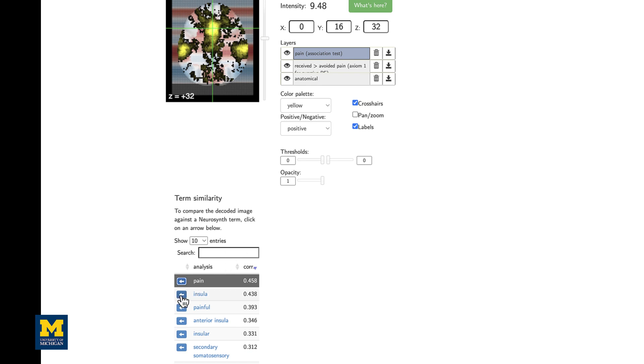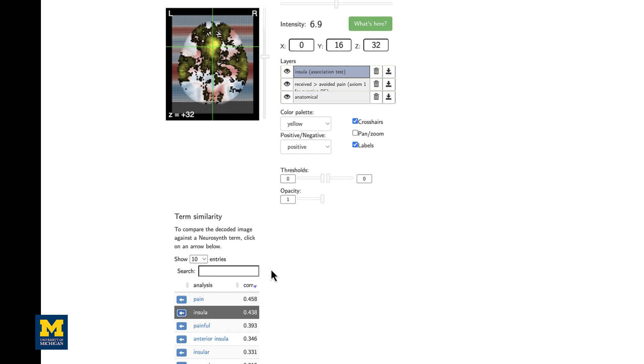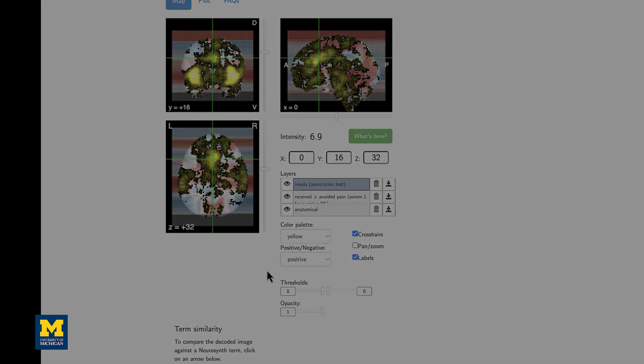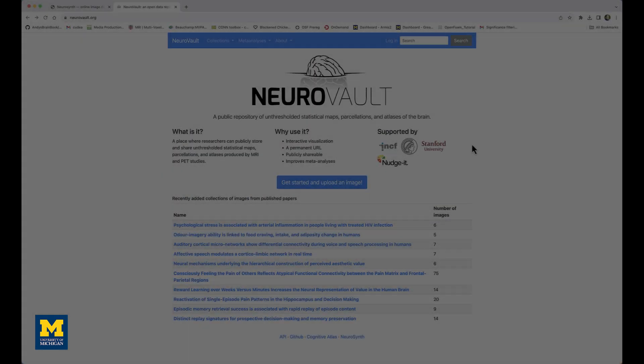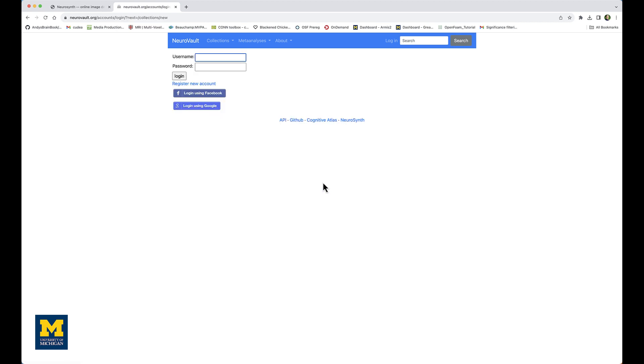And you can select other ones as well, such as insula, to see where that meta-analysis map shows the highest amount of correlation with that map we've loaded from Neurovault. The last method we're going to cover is uploading our own image, and to do this we're going to go back to neurovault.org and click on 'Get started using your own image.'